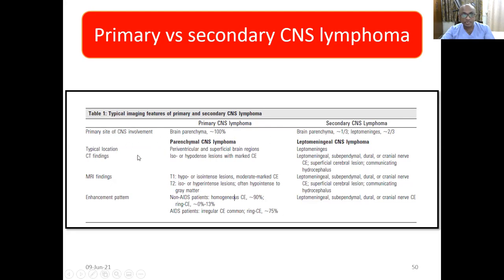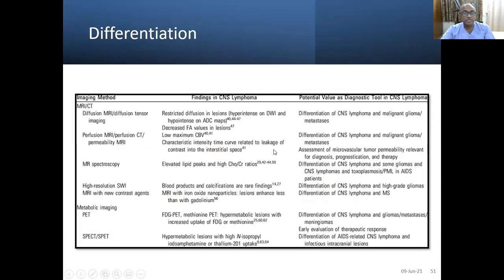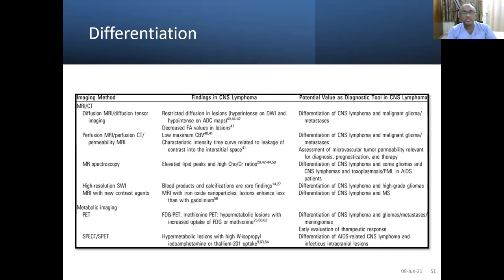In primary CNS lymphoma it is mostly a parenchymal lesion; in secondary CNS lymphoma it is leptomeningeal involvement. When multiple lesions are present, differentiate from metastasis; when there is a single high-grade-appearing lesion, differentiate from GBM. I have explained how to differentiate brain secondaries and GBM, including diffusion weighted imaging and perfusion. Thank you very much.